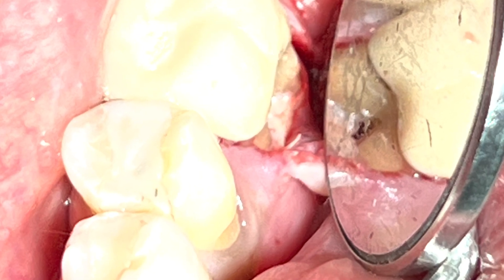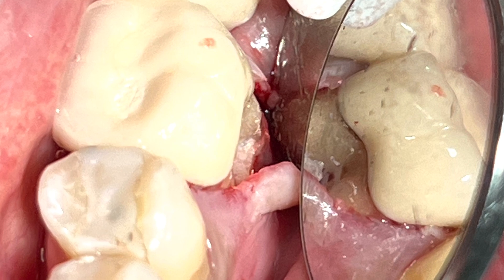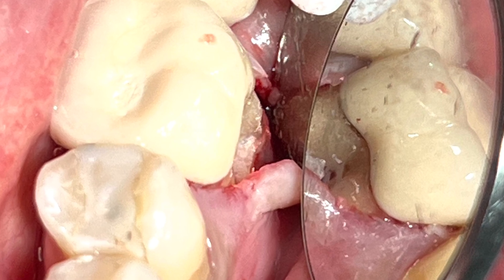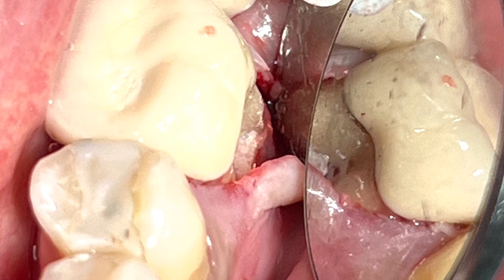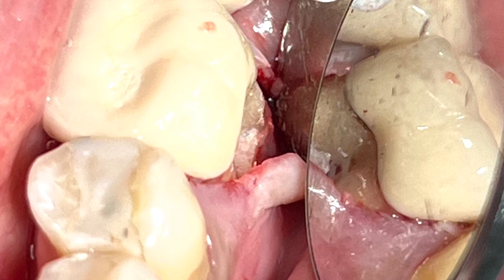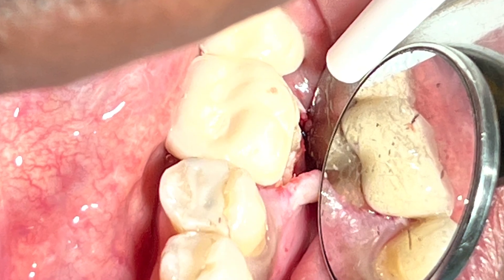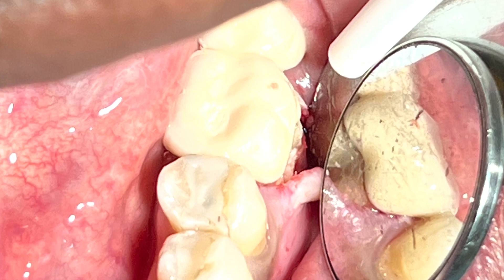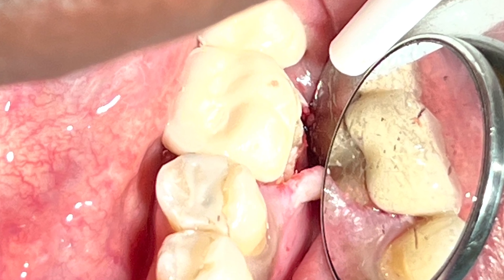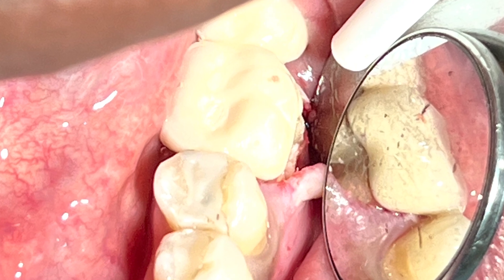But then I found out on the mesial aspect of the vertical root, there is a vertical fracture. So the decision I had to make in this case was to remove the tooth. That changed the entire treatment plan — instead of saving the tooth with bone grafting, I decided to remove it because of the vertical root fracture.